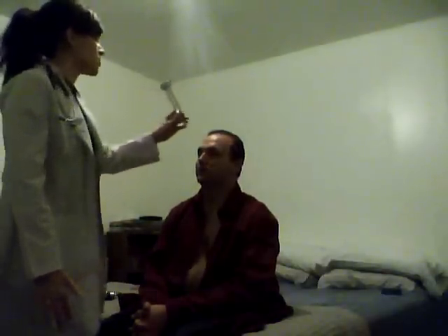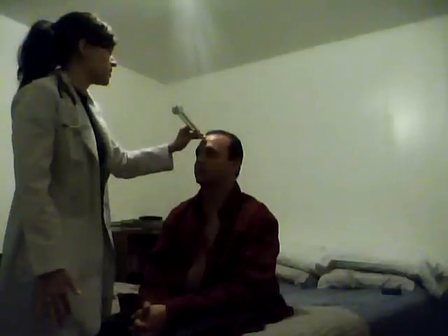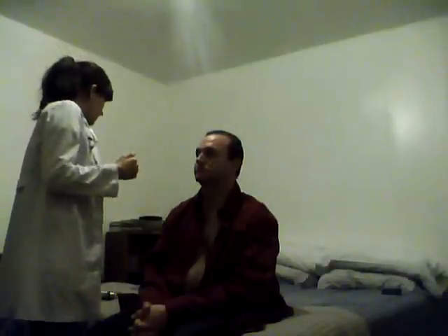Next, you're checking to see if there's any lateralization in the hearing. So you're going to strike your tuning fork again and do the Weber test. Place it up on the top of the forehead. Let me know which ear you hear that in. Okay, and then that is very good. You should hear it in both equally. So that completes the ear exam.